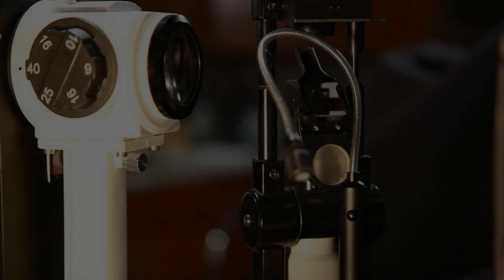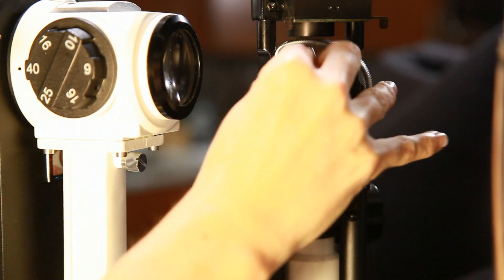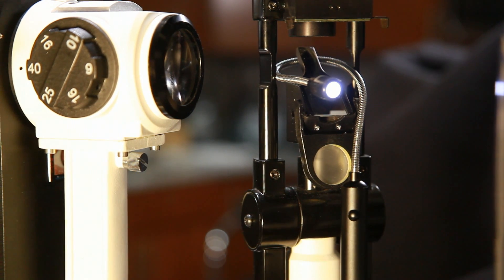Wrap the gooseneck light around the exterior of the slit lamp. Take the extension of the mirror and point the light at the same target as the slit. Note, the background illuminator need only be switched on while acquiring slit images.